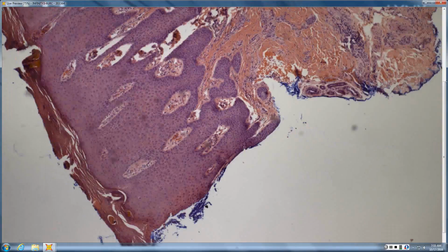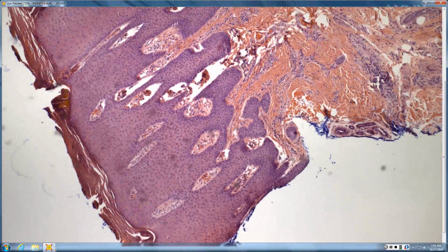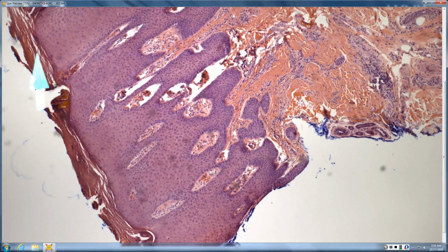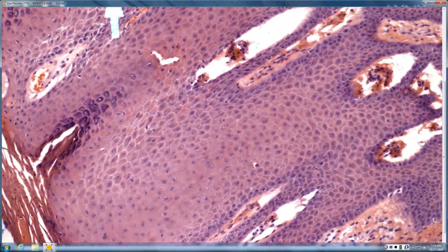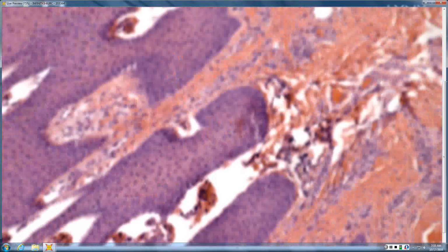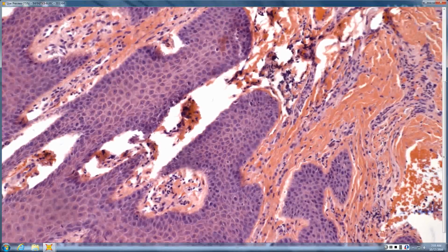There's definitely irregular hyperplasia or acanthosis. There's confluent parakeratosis as well, and little bits of serum, probably. Maybe a little bit of wedge-shaped hypergranulosis in a couple of the areas, and then it looks like there's dermal fibrosis and a little bit of spongiosis. So spongiosis, dermal fibrosis, papillodermal angiofibroplasia with vertical streaking of collagen.